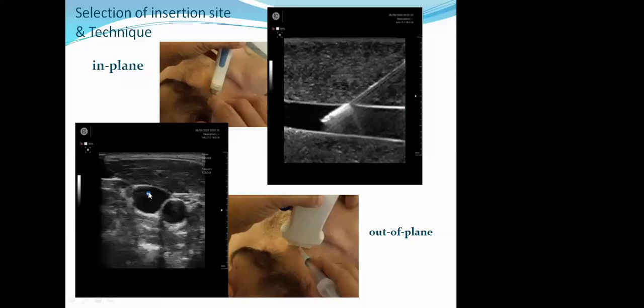It is very important for a trained operator to follow the dot as it extends from the skin all the way towards the vein. Most operators like this technique, but it depends upon the practice of the operator, whichever mode he or she adopts, whether in-plane or out-of-plane. The main purpose is that you see the needle when it is inserting into the vein, and it should not puncture the posterior wall.